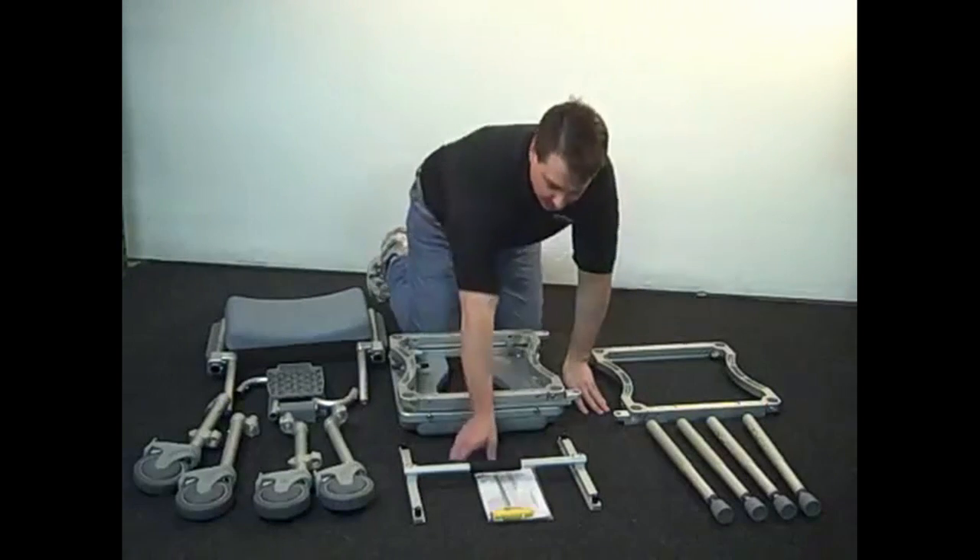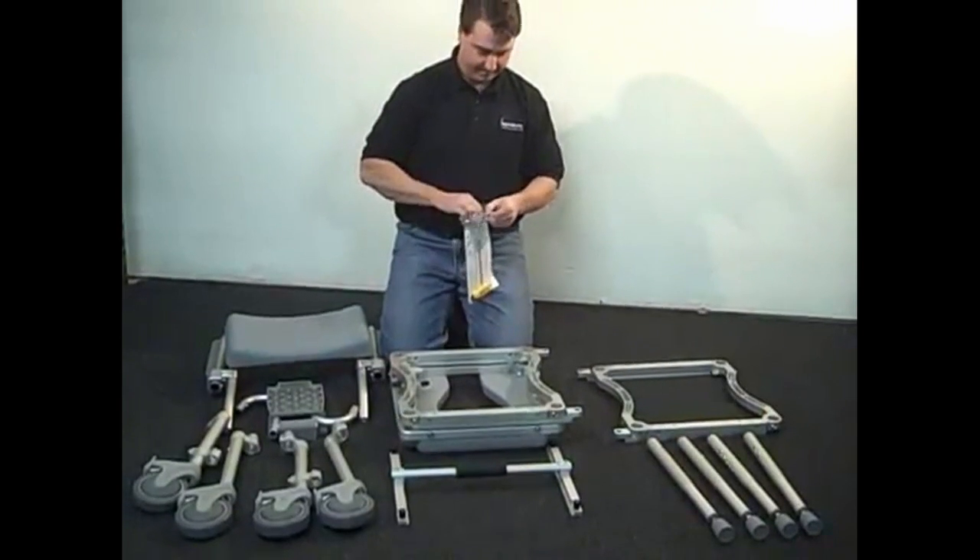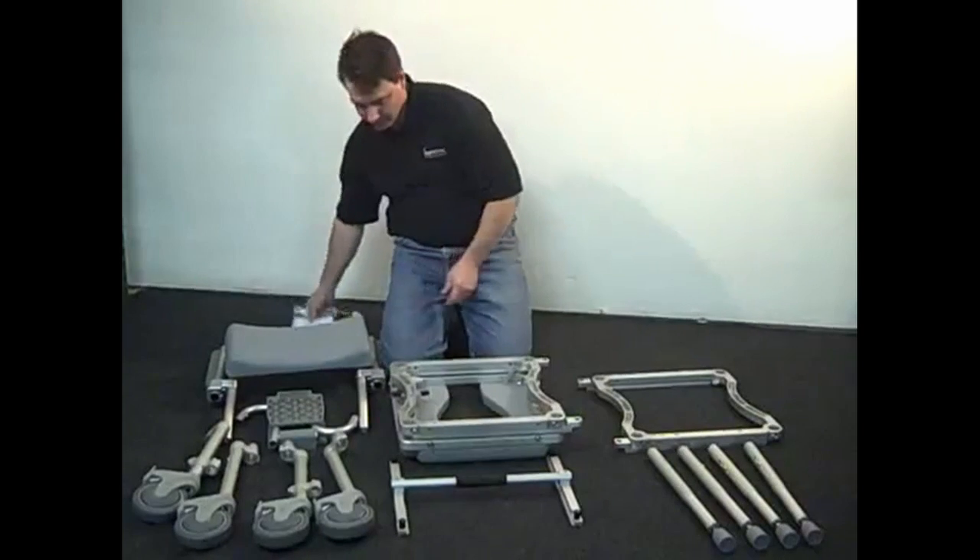The first step is to assemble the rolling section. Take the pair of frames that are attached. With them facing downwards, install the four offset legs with caster wheels.